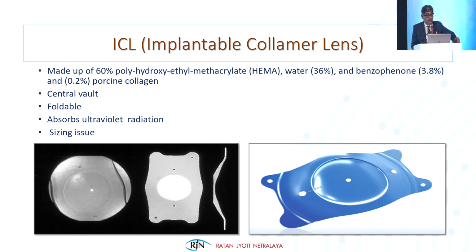I will focus on this. Coming to the ICL, which is made of 60% polyhydroxyethyl HEMA material with 36% water content, and it is made up of porcine collagen. And there is a central vault.